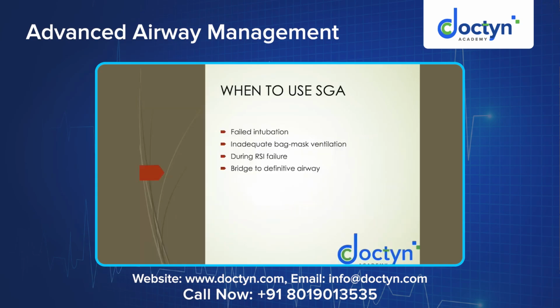So when to use a supraglottic airway? There are different aspects where the supraglottic airway can be used. So it can be used as an immediate airway measure once you have tried intubation.